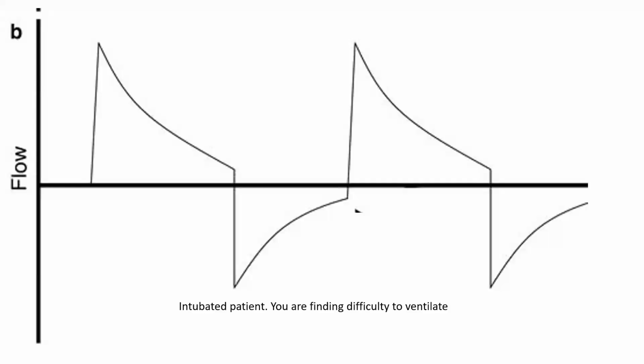Where the expiratory limb is not touching the baseline, before that the inspiratory phase has begun, ma'am. Yes. So what you call this is nothing but auto-peep. Auto-peep, okay. Yes, auto-peep or expiratory flow limitation. If you see over here that the expiratory flow, instead of touching the baseline, just short of touching the baseline, inspiration has already started. Somebody mentioned hyperinflation. Yes. Remember, auto-peep and hyperinflation are linked, but they're not exactly the same. As this process increases continuously, there's breath stacking, and that leads to dynamic hyperinflation.